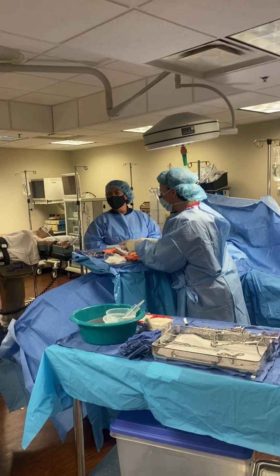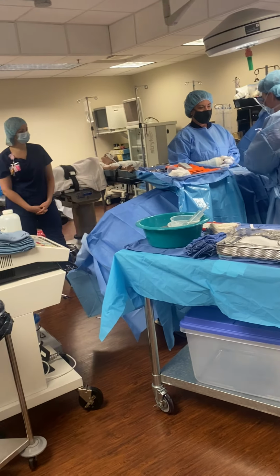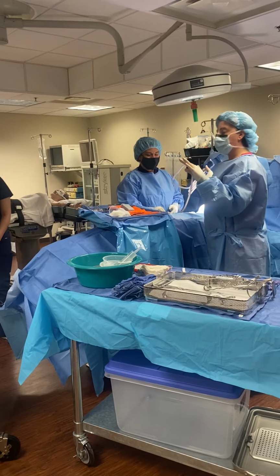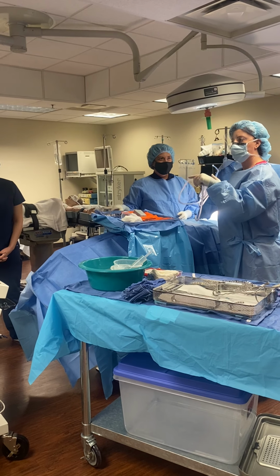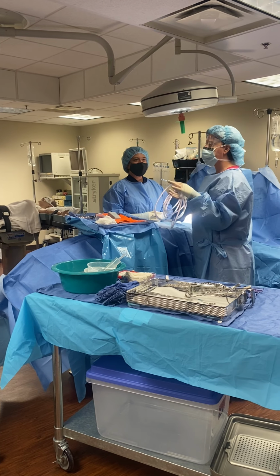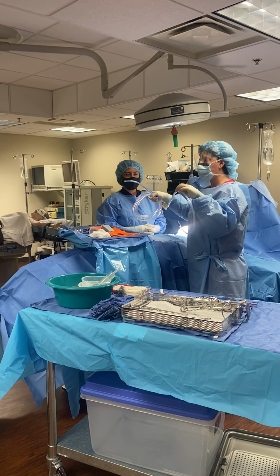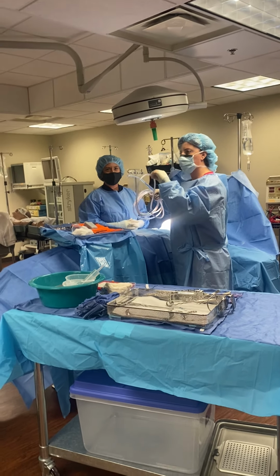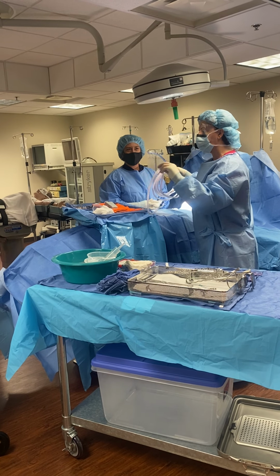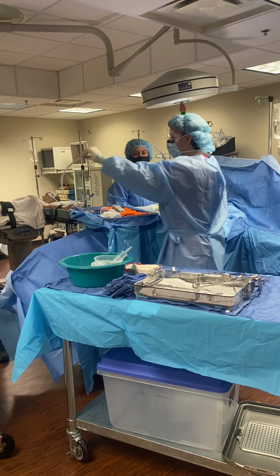And then we have a couple cords that we need to pass on. The way I typically teach this, Mr. O'Hare, is get your orientation, know where your equipment is. It could be up above the head, it could be over there, it could be over here, wherever. Just don't expect it to always be in the same place. And then control what you're gonna keep on the field, right? You can always dish out more, but you can't pull back onto the field once it goes off. You wanna make sure that you're far enough over your field that your circulator doesn't reach over onto your field, and you wanna leave 12 to 18 inches worth of distance.